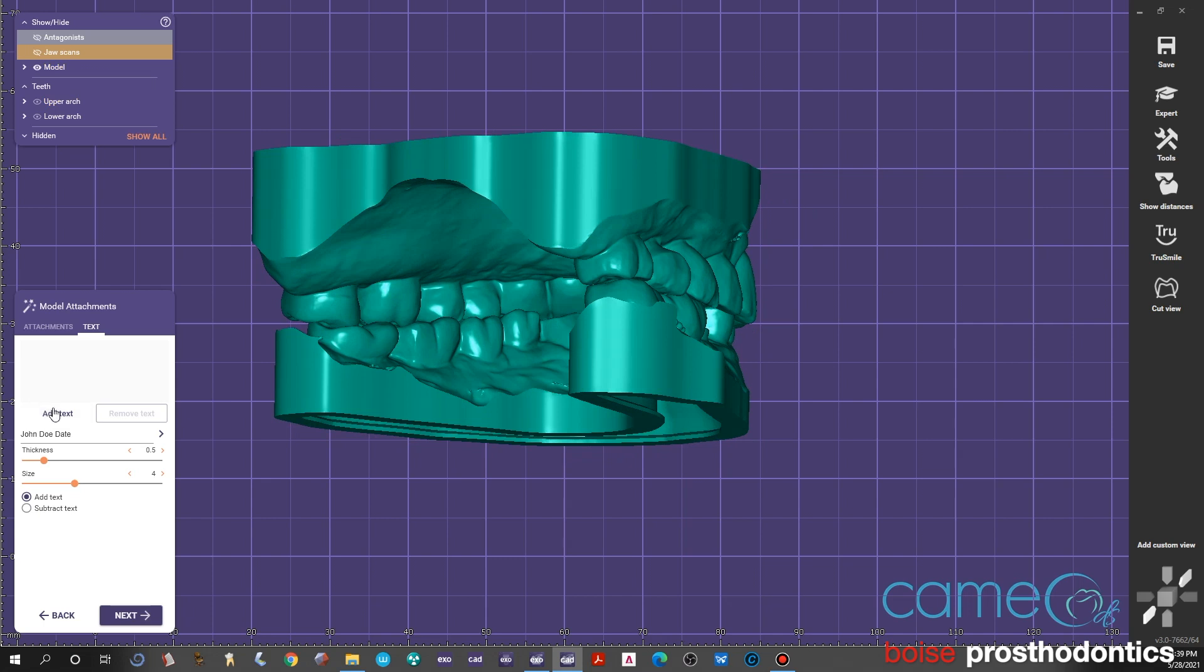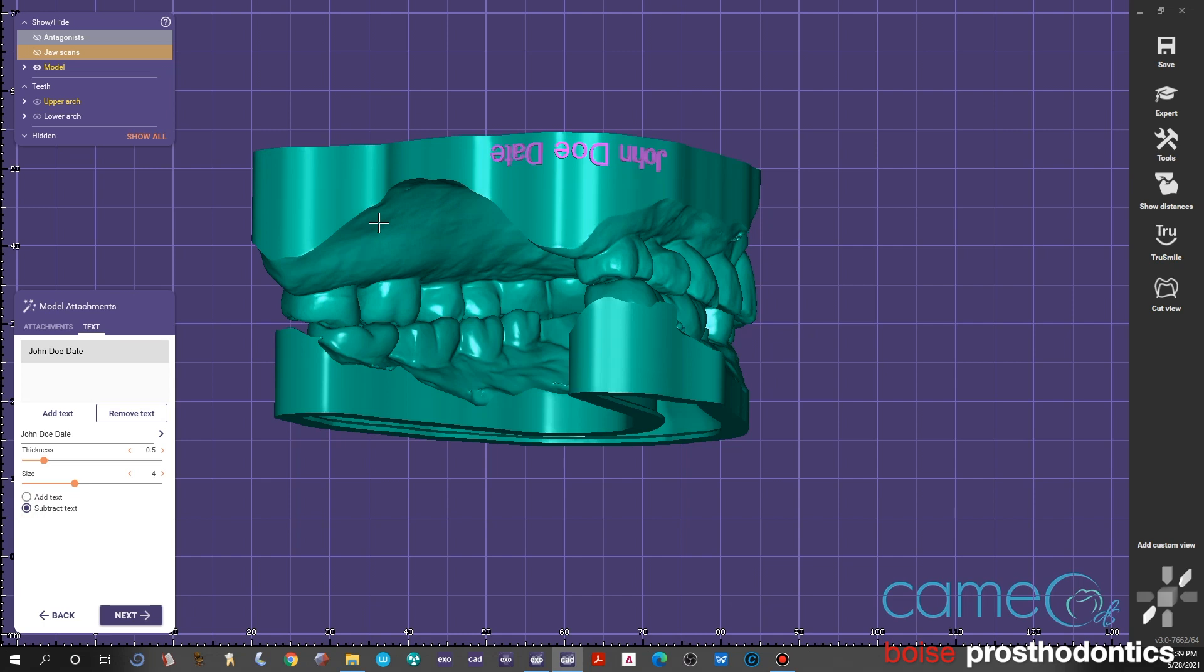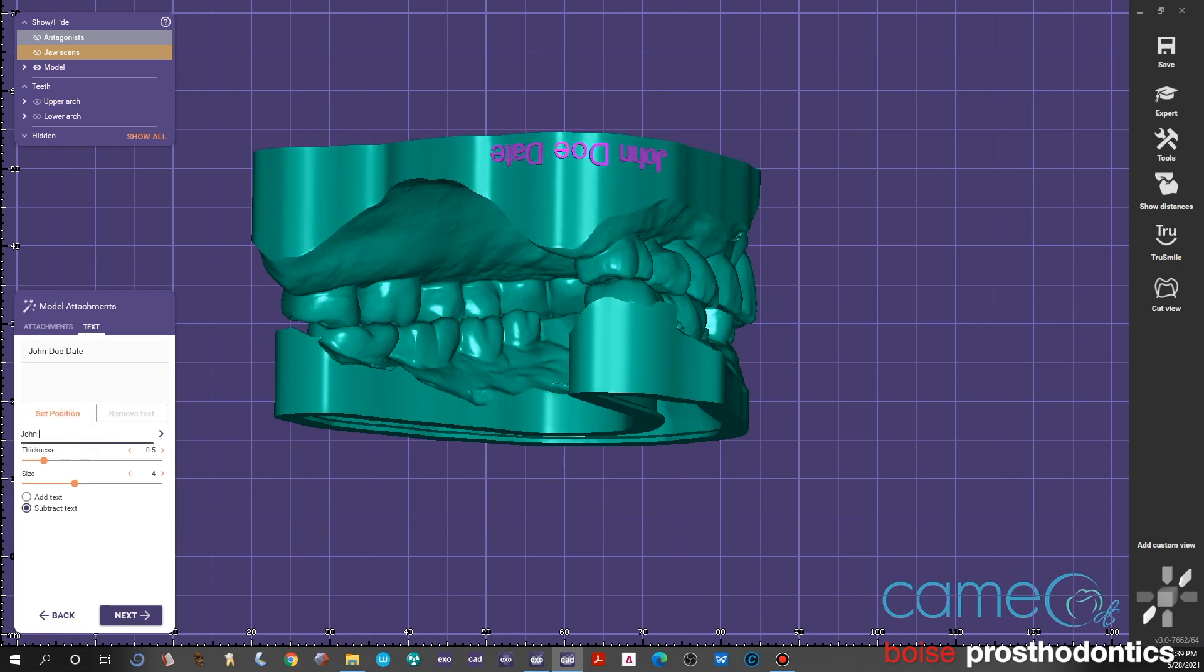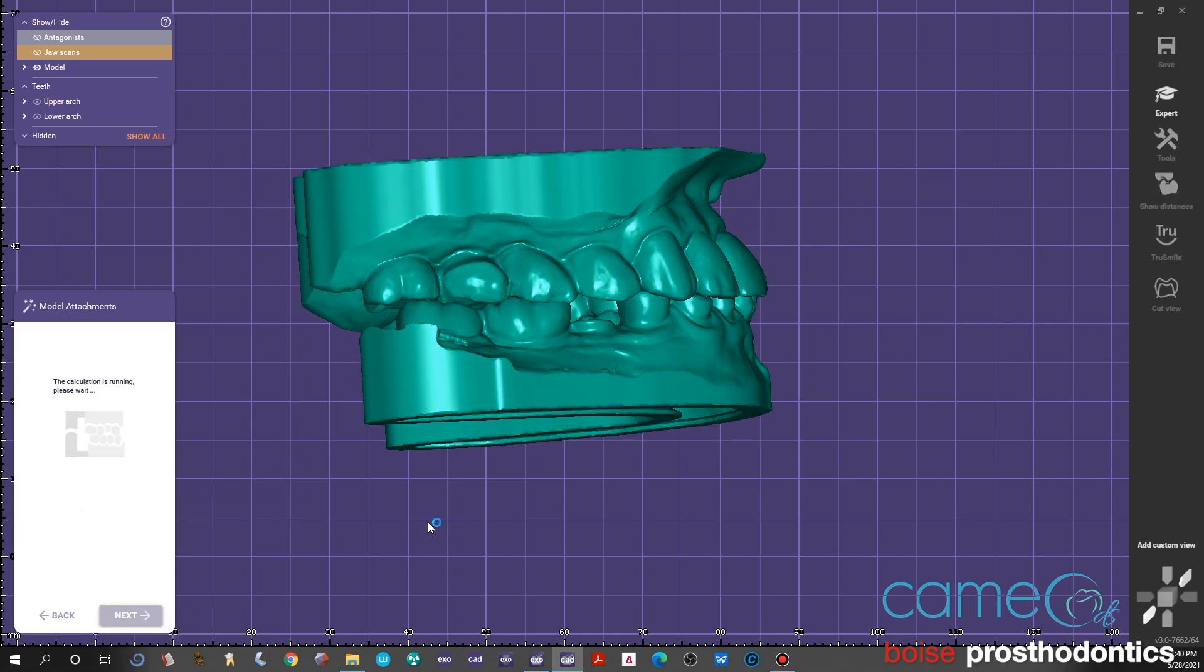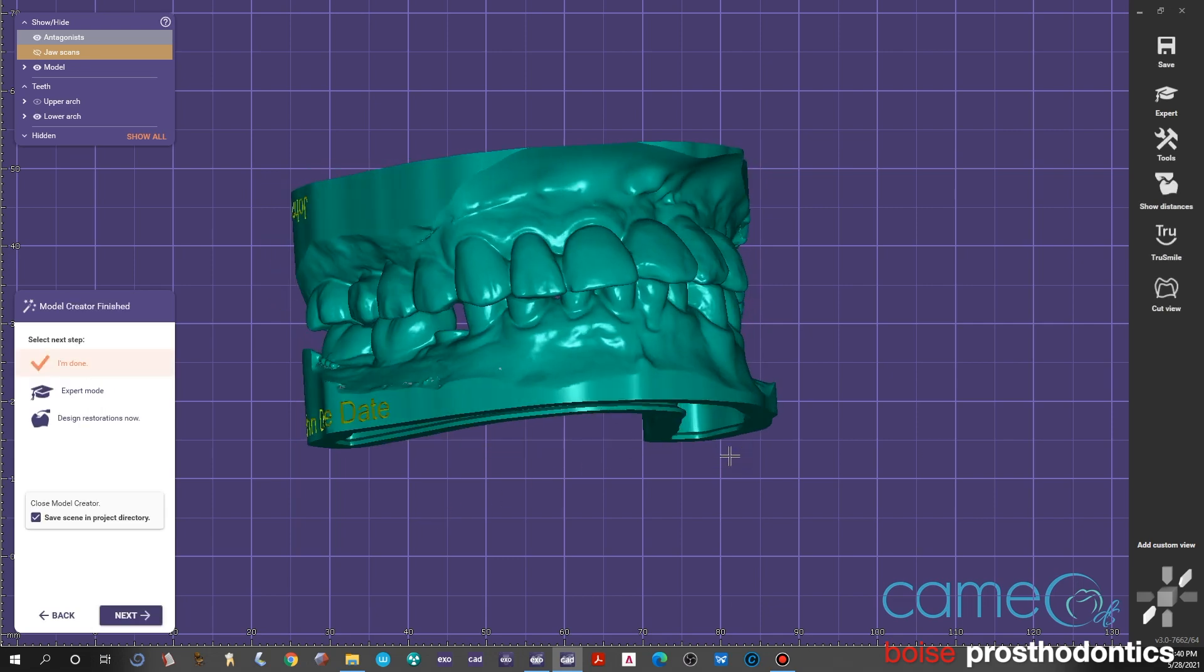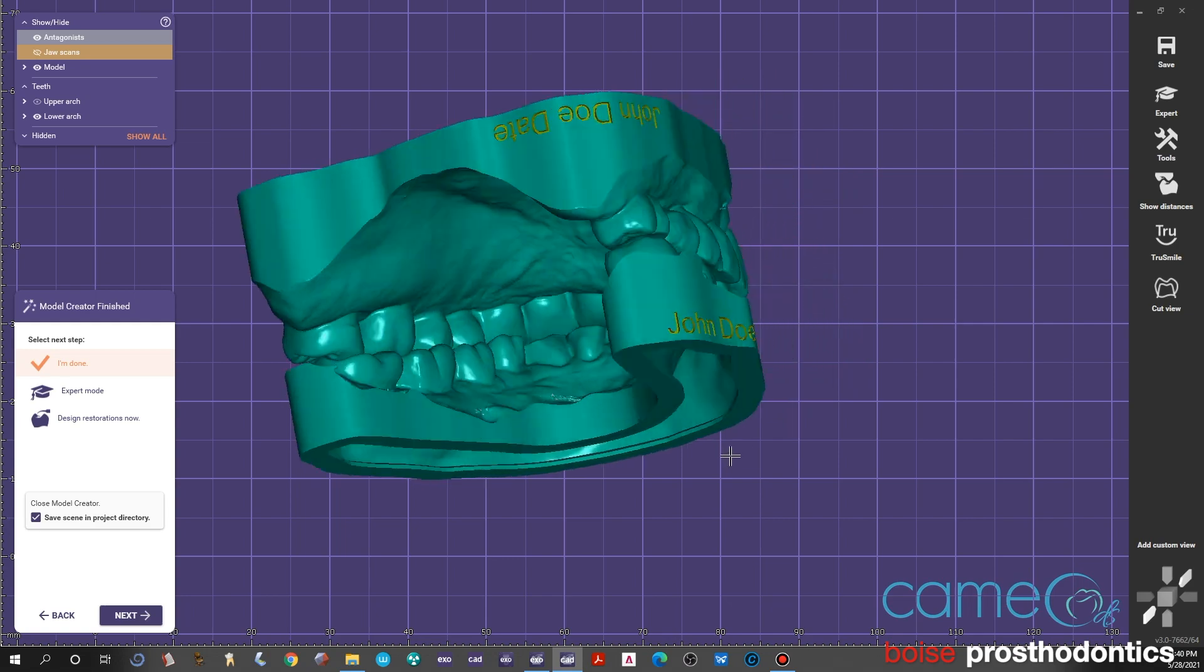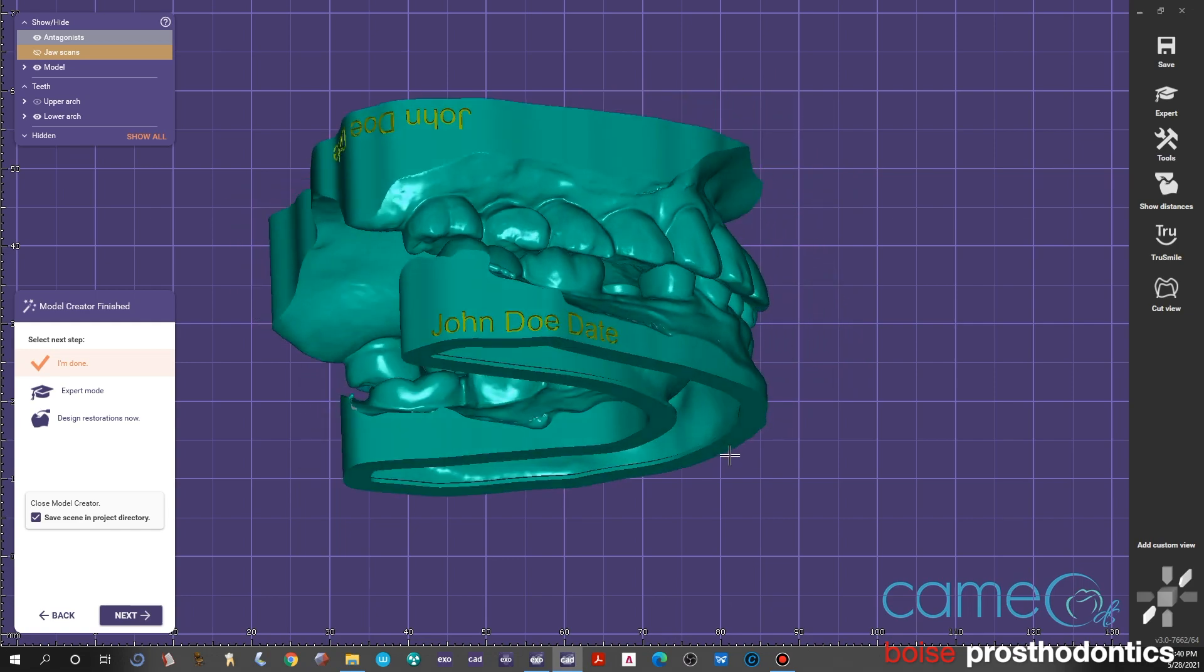We'll type in the name John Doe and a date, and then do subtract. We didn't hit subtract on this but we'll set the position. In this case it's going to build it out from the model—it's going to be a positive name. Usually we want it to be into the model, so we hit subtract and now it's changed. We'll usually do that on the mandible as well so that we know exactly who it is. You can add text—it'll ask us to type it in again. Sometimes I'll right click it and copy and paste it and go next. It'll calculate it and make the imprint into the model, and at that point it should be ready for printing.